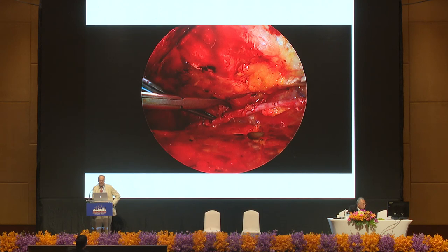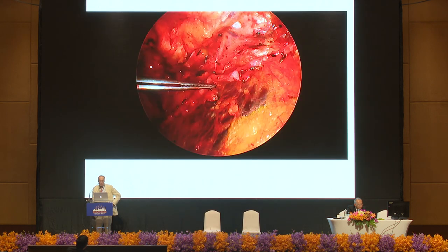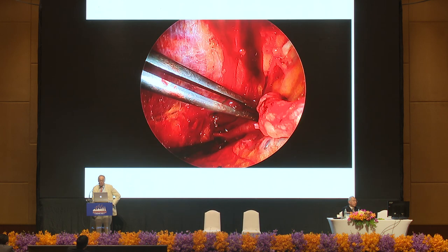I mean, it's neat, it's small. You can understand why there's less devascularization of the chest wall. No big diathermy burns along it. And with those branches, you can see those two clips there, and that's a nice long pedicle. It's not going to compromise the IMA, and you'll have a nice stump, so the clip is very unlikely to come off or give you problems.